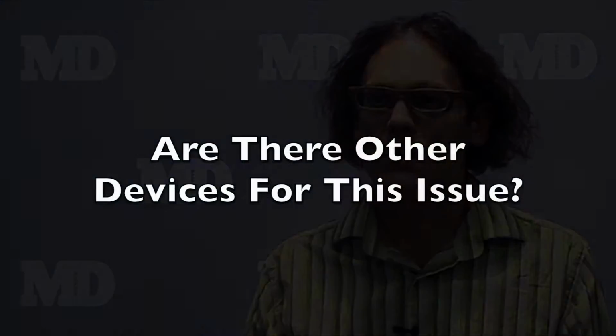It's to be able to count seizures in those who are having a hard time counting seizures. So they either have complex partial seizures where they may not even know that they had a seizure, or they remember that they had a seizure but shortly thereafter forget. For those who don't have the mental faculties to be able to keep a seizure diary, and especially for children and neonates, and also those who predominantly have nocturnal seizures at night, those who are at risk for SUDEP, and so forth.